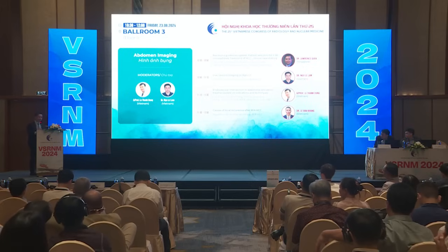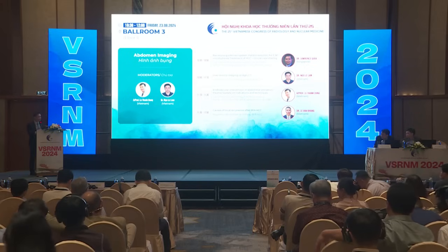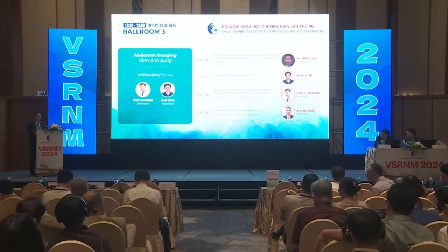Now, the reason why we use TheraSphere is because when you're doing radiation segmentectomy, they were the originators of using glass microspheres to do radiation segmentectomy, and we kind of followed what the literature showed. We spoke to the experts in North America and followed their way of doing it. And certainly, we got used to using TheraSphere for delivery.